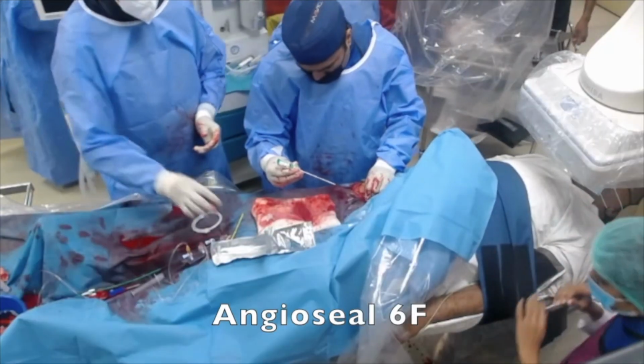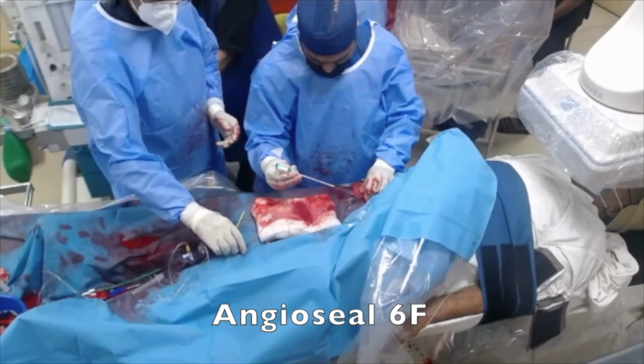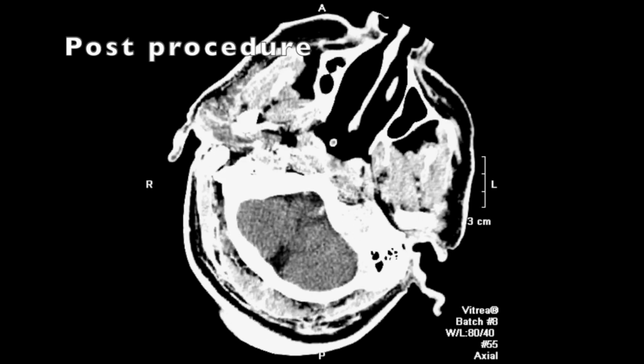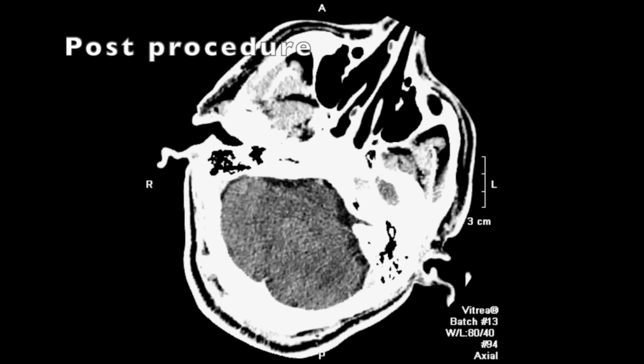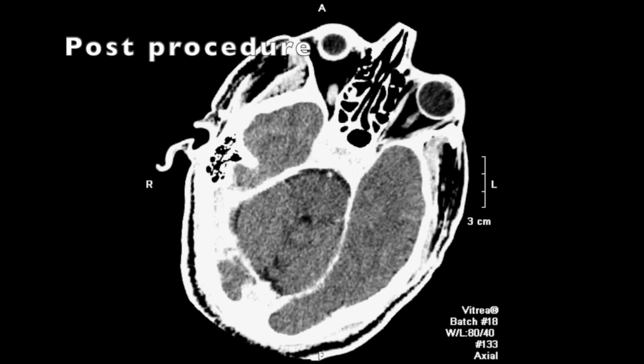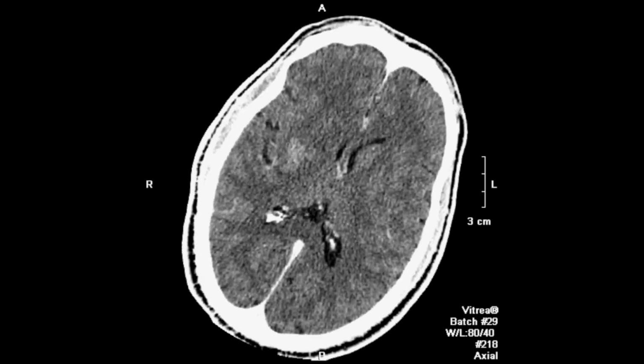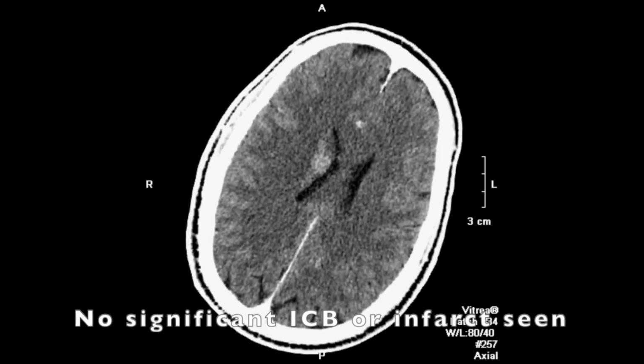We did a groin check, used an Angio-Seal 6 French to secure the access site, and this is the immediately post procedure CT scan, which you can see there is no significant bleed or infarct on this scan.